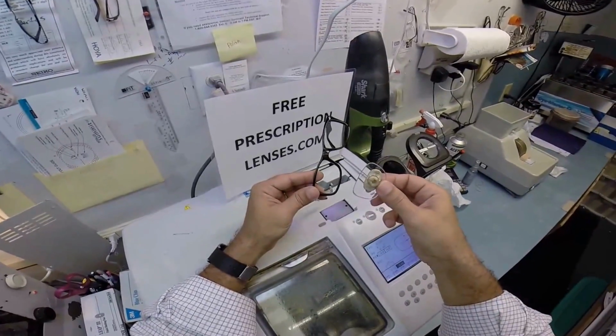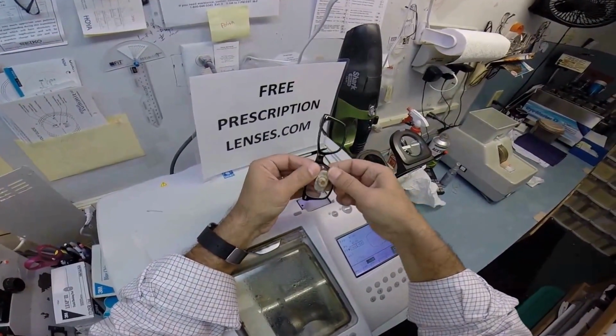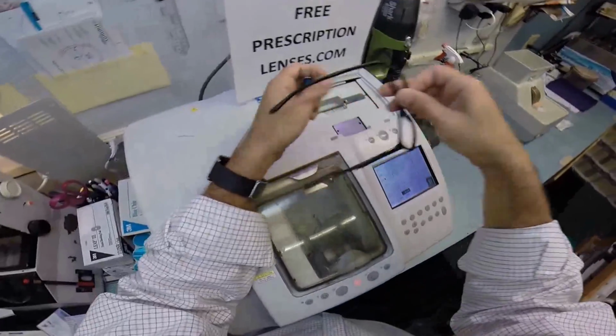But let's go ahead and get your lens mounted in the frame. I have the frame turned upright. I'm going to tuck your lens in at the outside corner. Then using my thumbs, I press down at the nose, and there's still a little bit of give, so I don't want to force it in there.